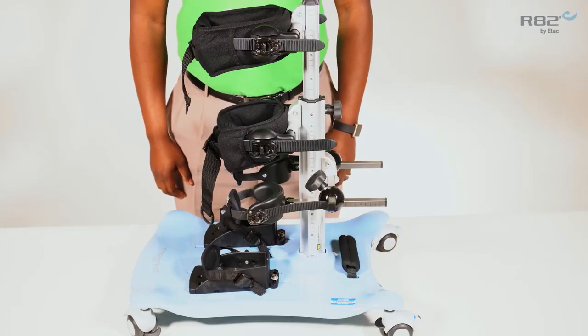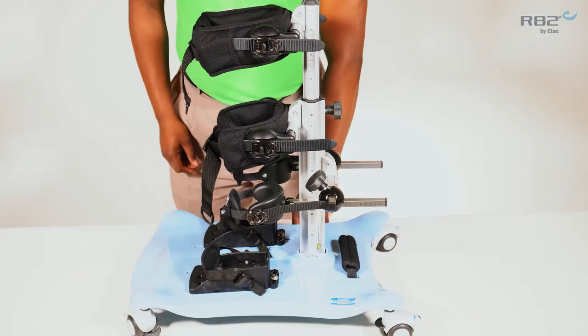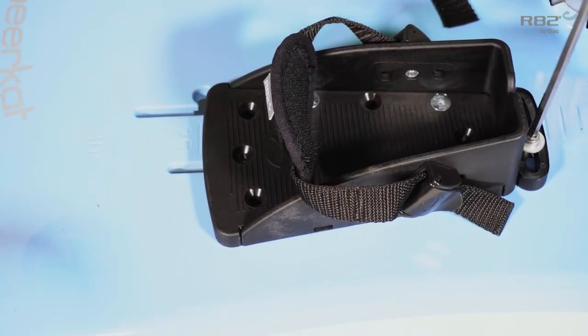To convert the Meerkat for anterior use, you simply need to flip your sandals. Loosen the footplate, slide it over and out of the track.